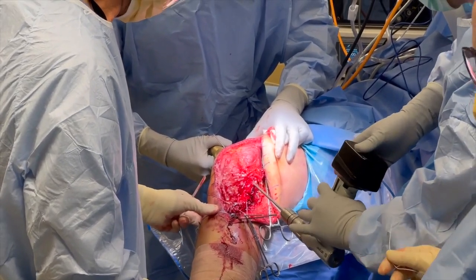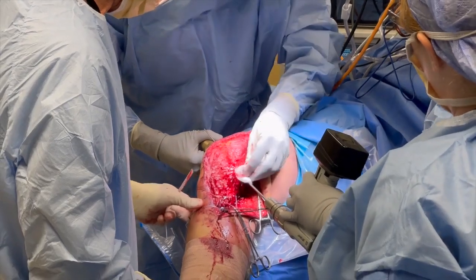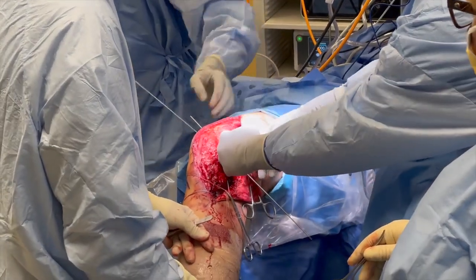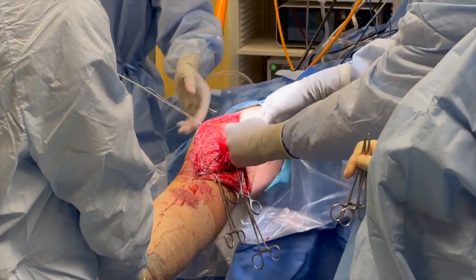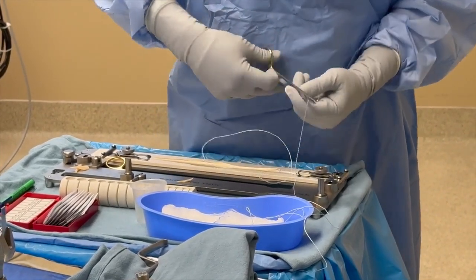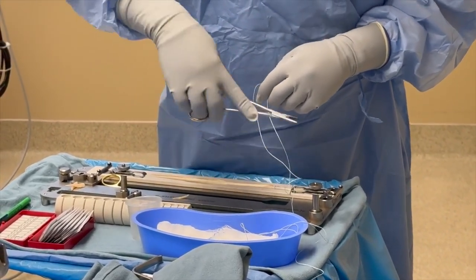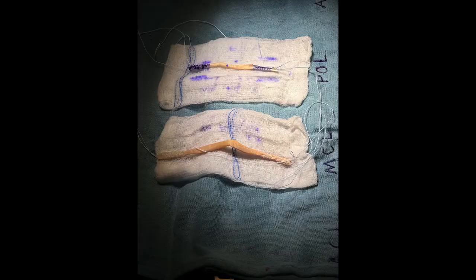It is very important to pass both guide pins and verify that they are both in the desired anatomic location, due to their proximity, in case one or both of the pins need to be repositioned. Next, both guide pins are overreamed with a 7 mm reamer to a depth of 30 mm and passing stitches are placed. The MCL graft is prepared from a tibialis anterior allograft and is 16 cm in length, and the POL graft is prepared from a semitendinosus allograft and is 11 cm in length. Both grafts are whip stitched at each end with number 2 non-absorbable suture.